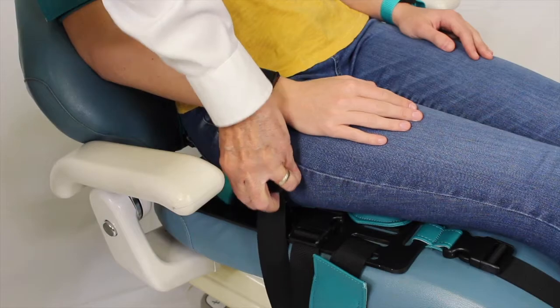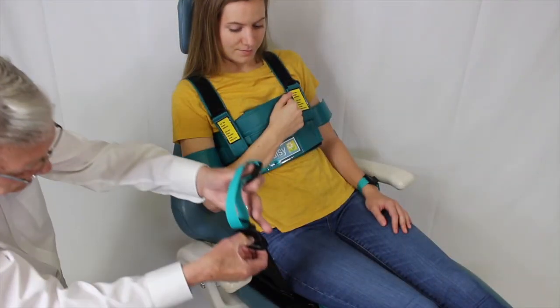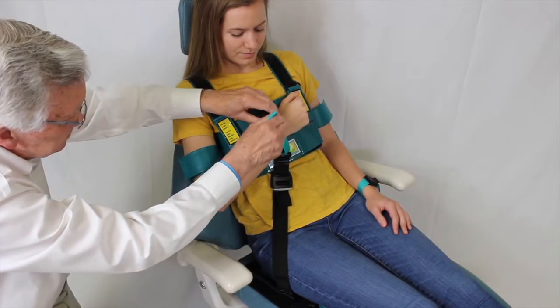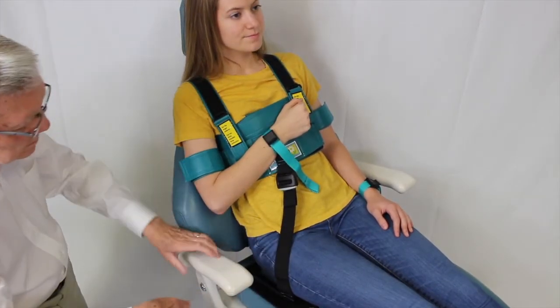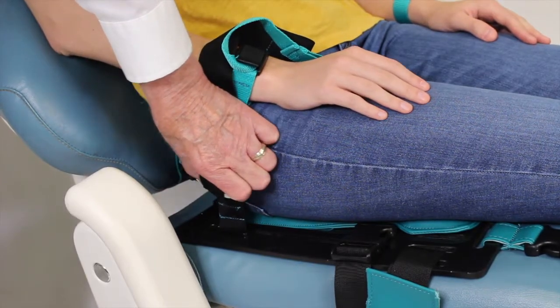To shorten wrist straps, pull on the strap end. To lengthen, press the gray button on the adjuster and the length strap. The wrist straps are adjustable for patients that cannot straighten their arms. Adjustment is simple and the arms can be positioned into a comfortable position for the patient that cannot straighten their arms. Push the gray button on the adjuster and make the length adjustment. Each arm can be adjusted separately depending on the patient's needs.